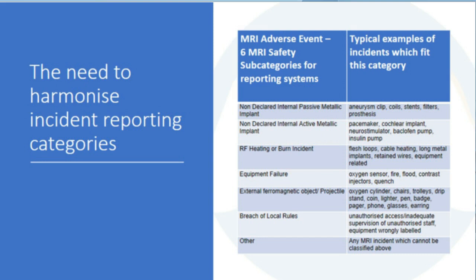The Scottish Incident Reporting Centre are also now developing a trending system so that every incident is visible on a chart over the previous 2 years. This means that people can see for themselves what's being reported. We will see the equipment category along with the suspected problem and, most importantly perhaps, the health impact. We're keen to hear what anyone thinks of all this because it's not mandatory to report, and anything that encourages us to do so can surely only be a good thing.